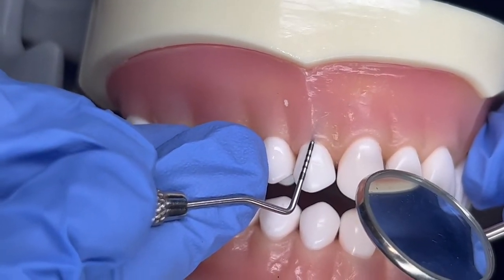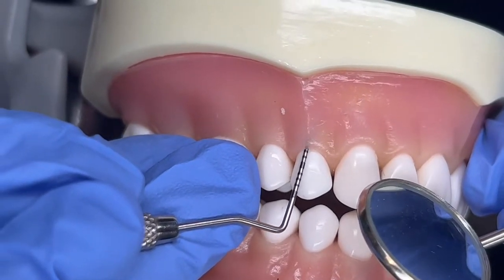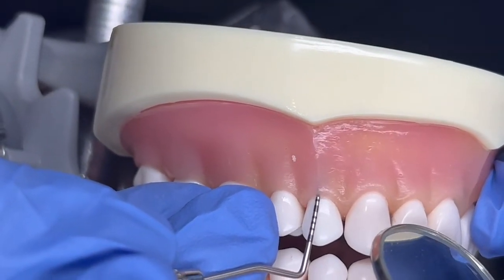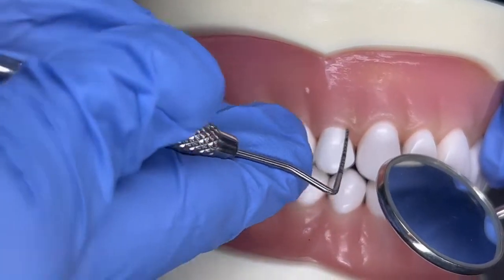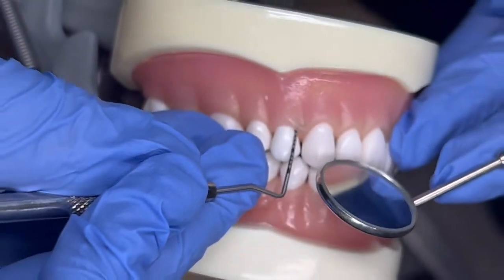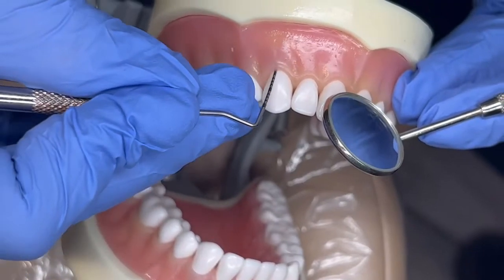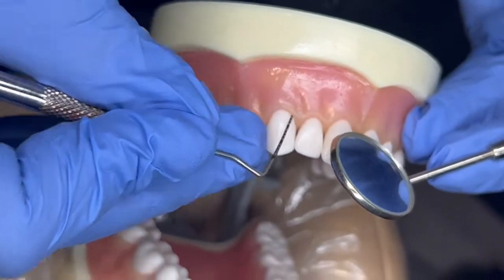This will hit bone when stopped, indicating a periodontal issue. So that was 5 to 7, 8, 9. The patient is usually not numb for this, so it's not pleasant for them. Readings continue: 5, 5, 5, 5, 6.